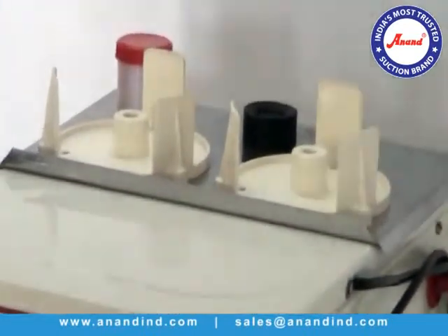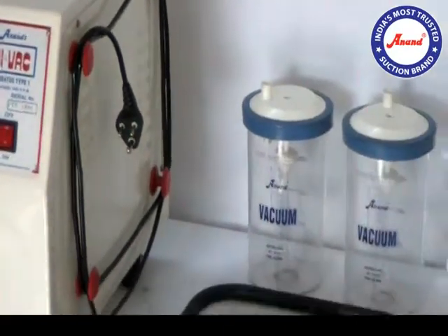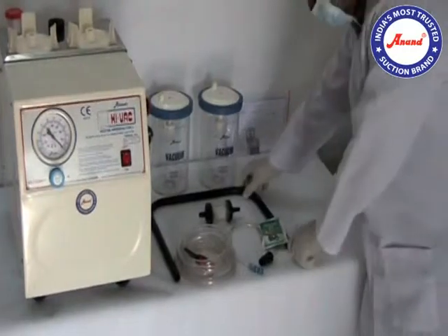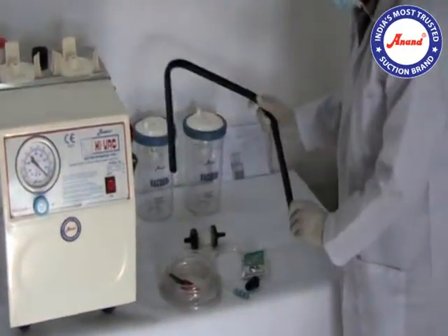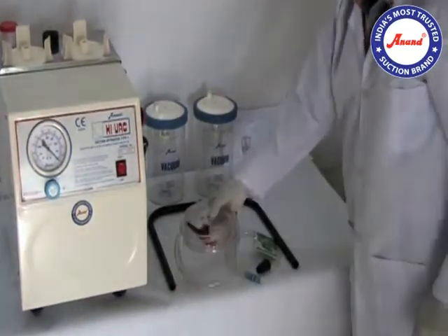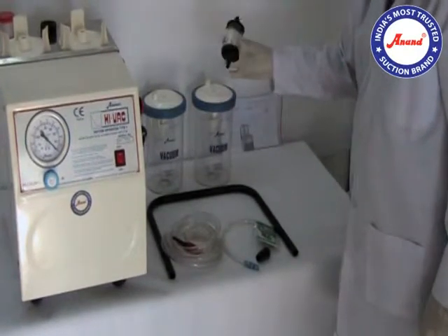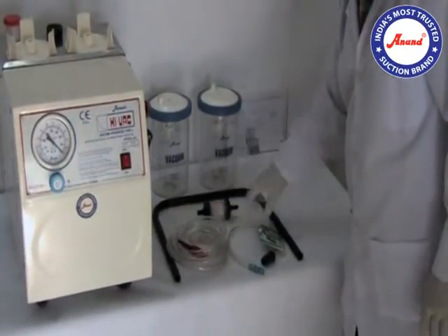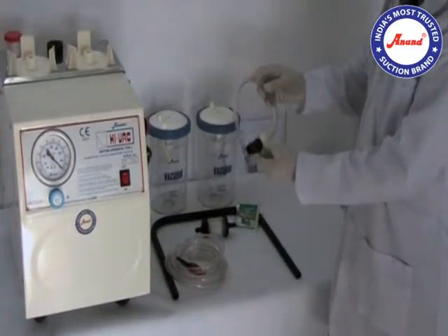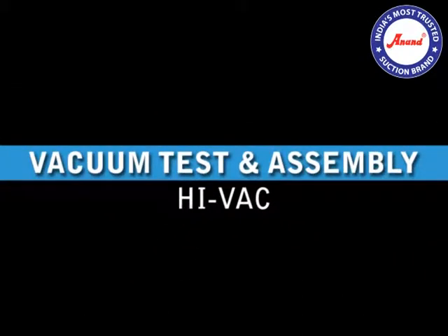This understanding has made Anand Medicades the specialists in providing high-quality suction units, consisting of two-litre jars, carrying handle, patient tube, filter, lubrication oil, filter tube, vacuum test, and assembly of Hivac.